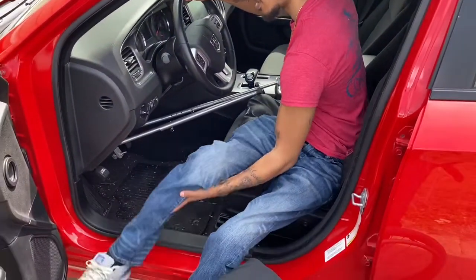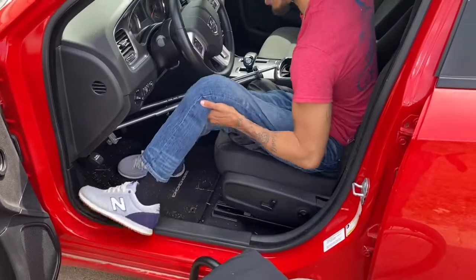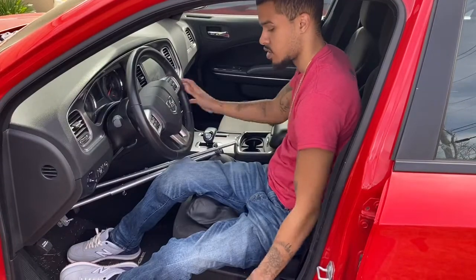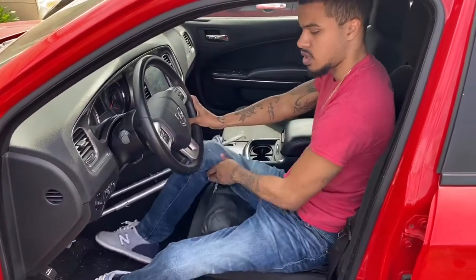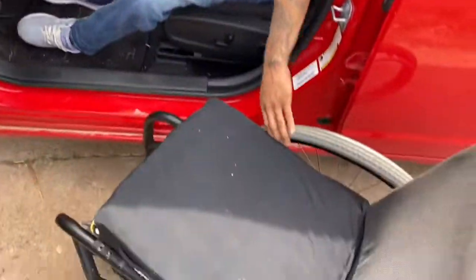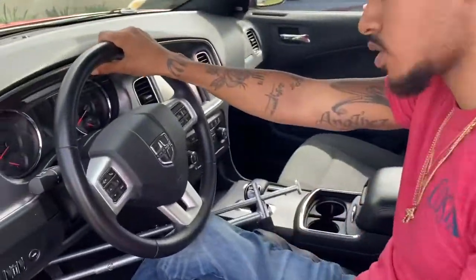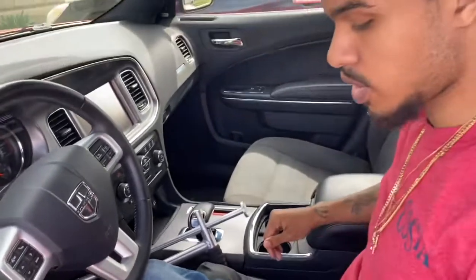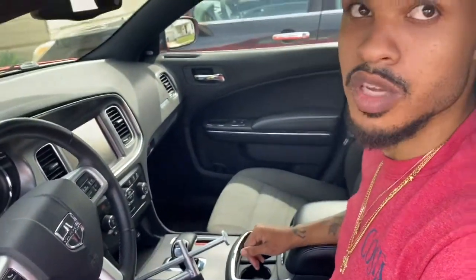Throw both your legs over and straighten yourself up. Then if you were about to leave, you'd just break the chair down, take both the wheels off, bring the chair across from you and put it over into the car. I just take the whole chair across my body. Sometimes I got to lean the seat back just a little bit to get more space to bring the chair over.